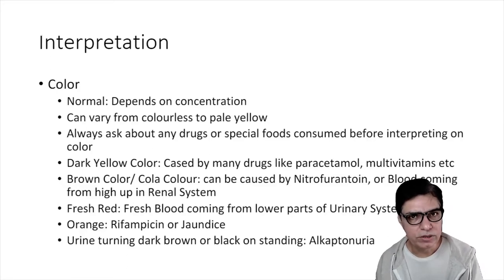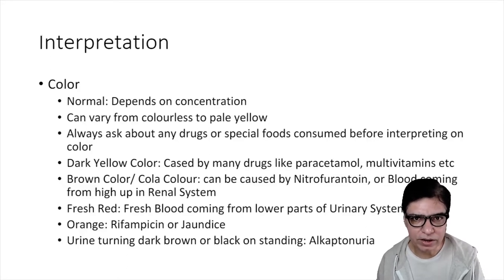So you need a clean catch sample for proper interpretation. Remember, if it is contaminated, then it would give you false results, and obviously on the basis of false results, your treatment can go in another direction.